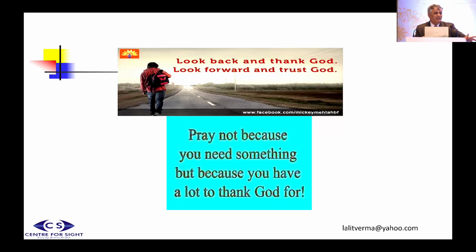In fact, it looked like he is more of a VR surgeon than an anterior segment surgeon, because he was going through pars plana. And some of the videos I have taken from YouTube, that red colored vitreous, I have taken from YouTube only.